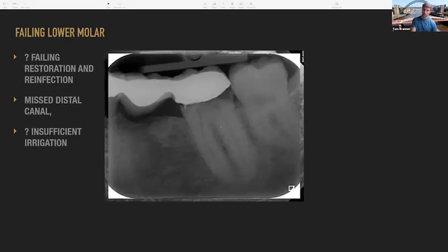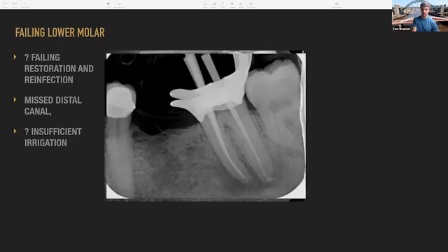I think this was a pre-op that was sent. So this was before another general dentist had attempted the root filling. You just see it's got a big leak in restoration. But once we've got all the old GP out, again, I think I used something like Reciproc, and I don't think I used any solvents. We can get it all out, take the bits out.